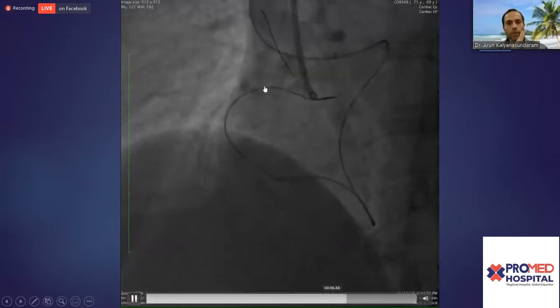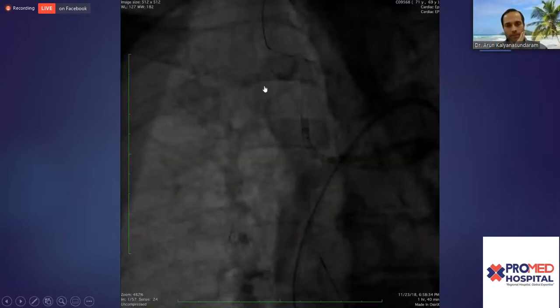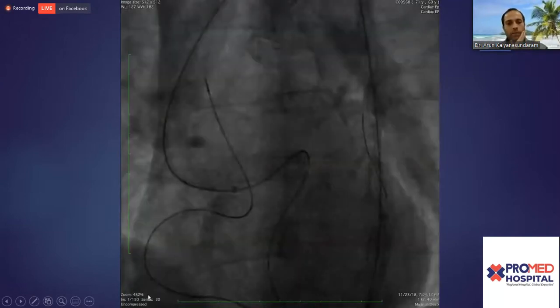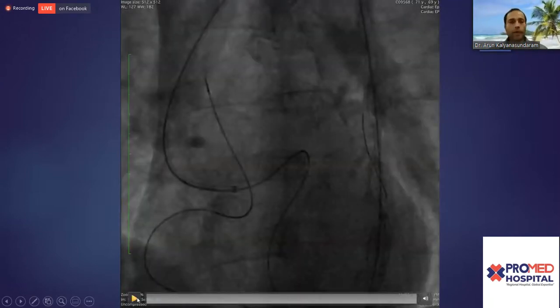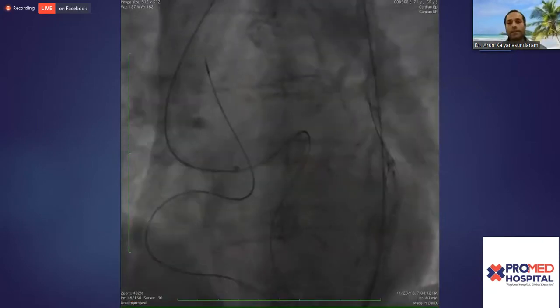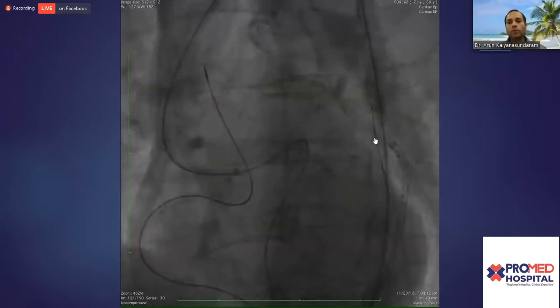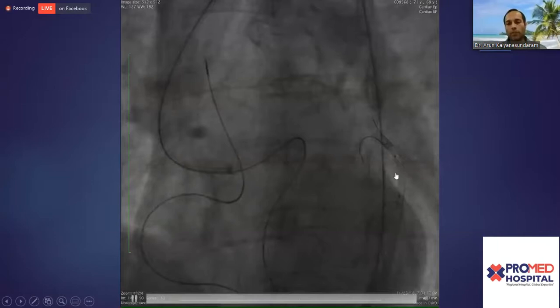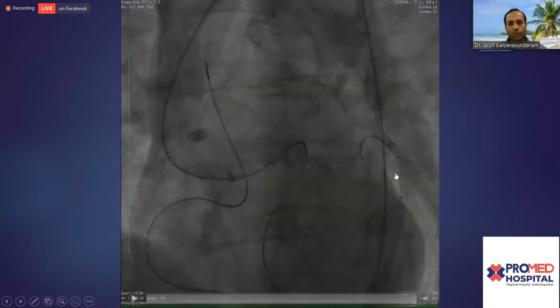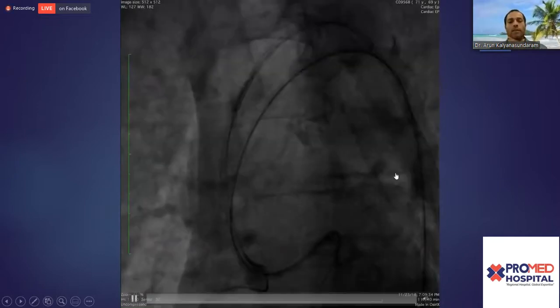That's the wire going up. And once this is done, I actually ended up snaring this in the descending aorta. Typically, the great vessels work great. Keep moving. In fact, we realized they didn't have a snare, but you should know how to make a snare. So that's another problem-solving thing. There you see it get into the JR4. And once it's done, the rest of it, again, I won't belabor the point. It was fairly straightforward. Get the microcatheter, reseat the guide, finish your PCI.